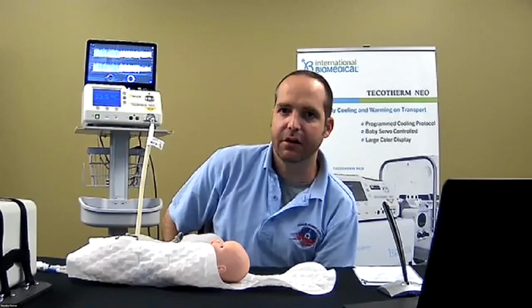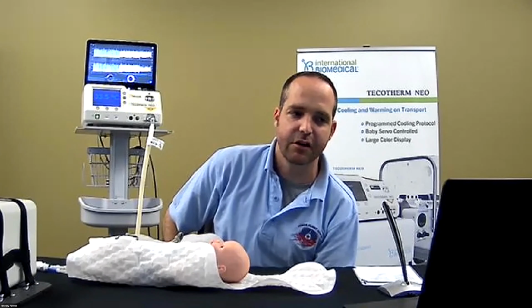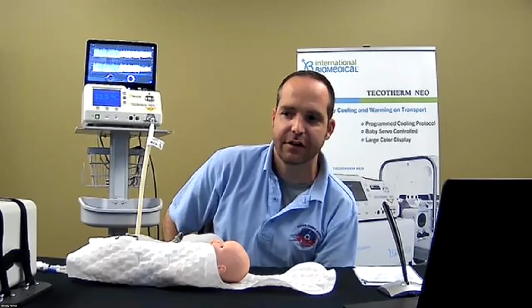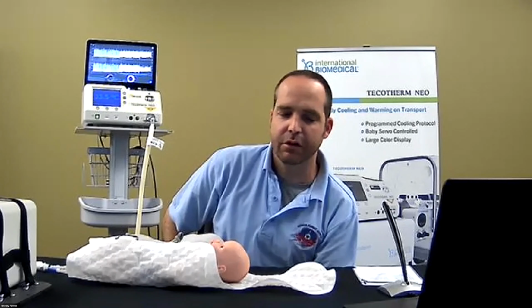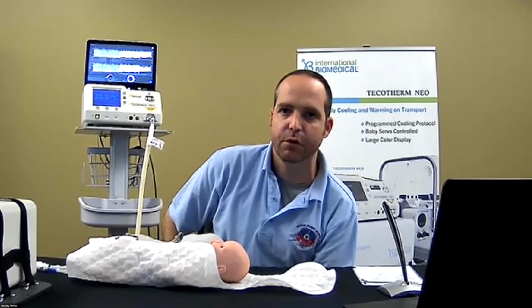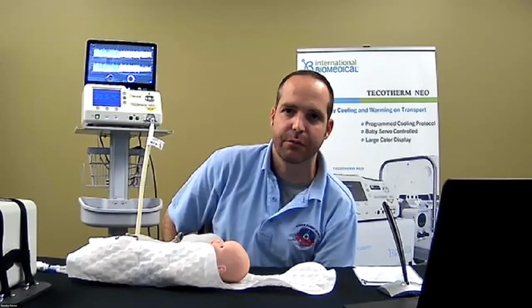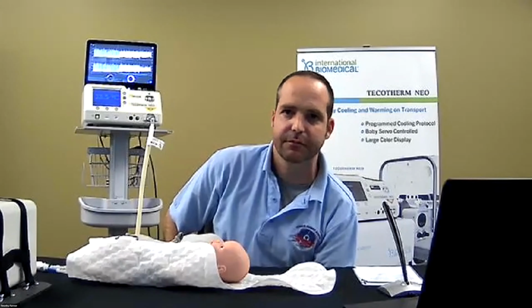And going back to your slides about those mild kids, with the Tecotherm, I feel like the neos are coming on board, thinking, all right, we can do this, we can do it safely. Let's broaden our implementation of this. Because as the data goes towards these mild cases with this device, it really gives us an ability to stretch out those level 3, level 4 NICU care to the rural community. So yes, the mild stuff is really interesting. For sure, determined by the physician once communicated with from the transport team on site.